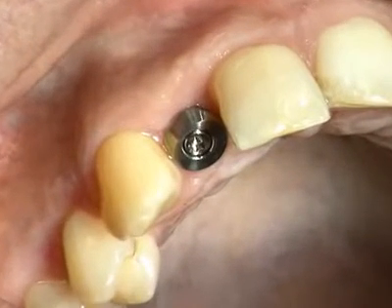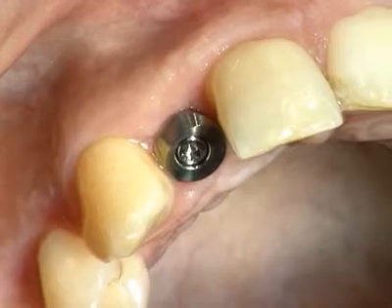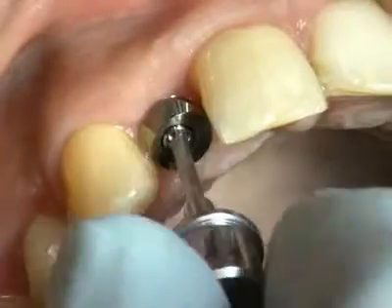After successful osseointegration of the Straumann standard implant regular neck in the region of tooth 1-2, the SES healing cap is removed and the interior of the implant is thoroughly cleaned.